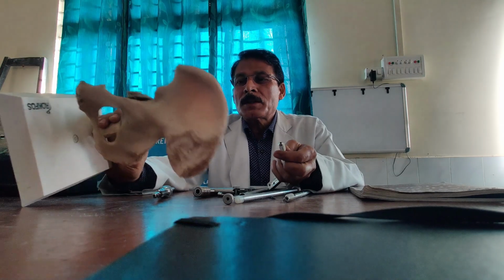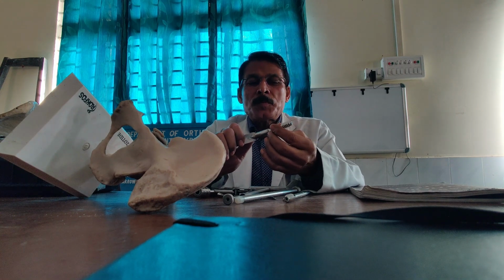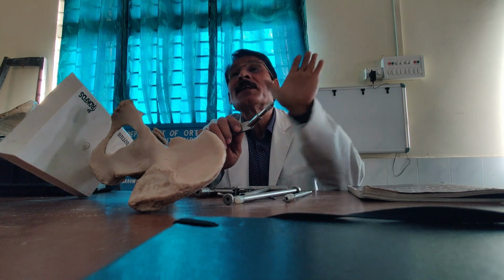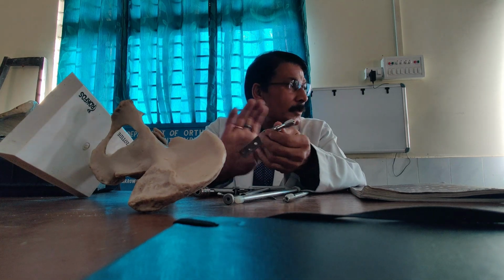So the third basic thing is the tension band principle. The tension band principle is applied on the tensile surface. Integrity of the medial wall is very important, as well as the lateral wall. It can be applied in combination with the lateral wall, but you need additional support. Yes, it is supposed to be. You can apply it in the lateral wall.